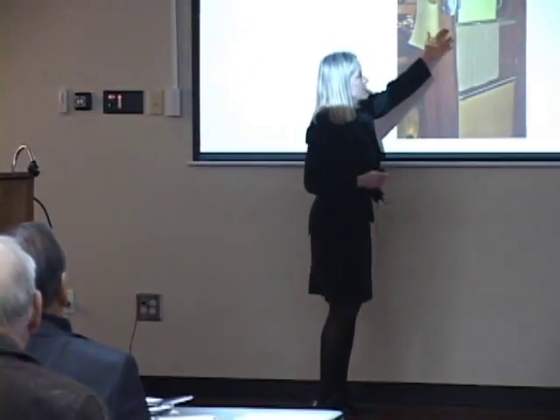I was telling Nat, I actually have one of these fluorescent screens, and I wanted to bring it, but the thing has leaded glass on it, and it weighs about 50 pounds. So I didn't bring it with me, but there's a museum in Albuquerque, New Mexico, where they actually have this that you can go and look at. But this is an old fluoroscope, and of course radiologists at one time had a higher incidence of leukemia from all of the exposure that they received, mostly during fluoroscopy, when they'd stand out in the room in front of this fluorescent screen, and they were basically the primary barrier for the radiation coming through.